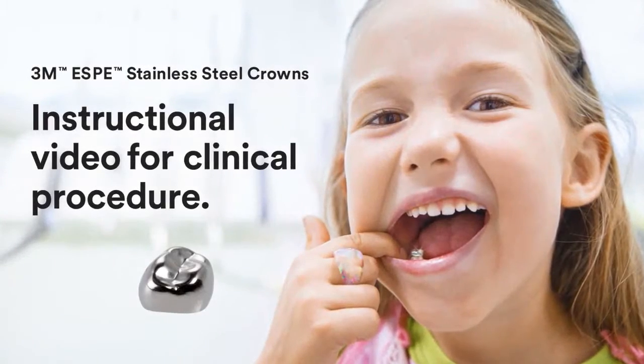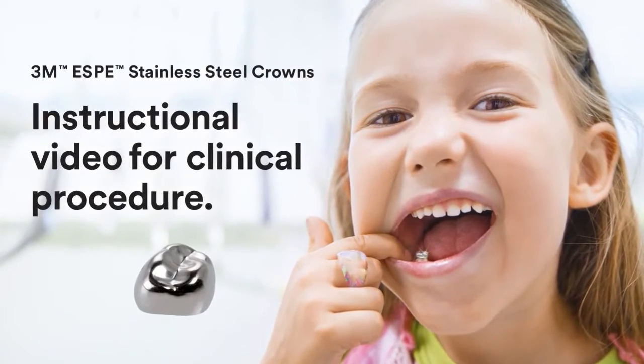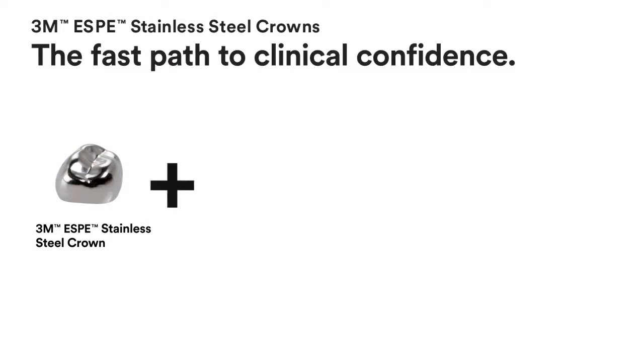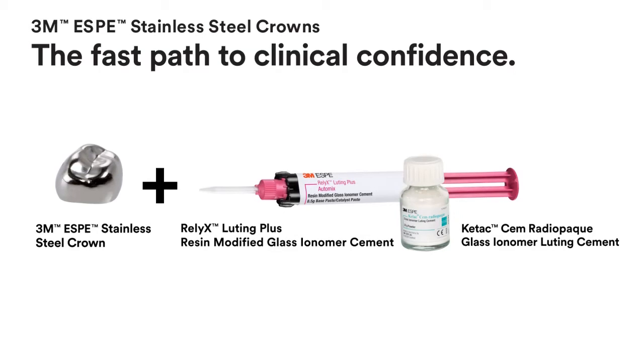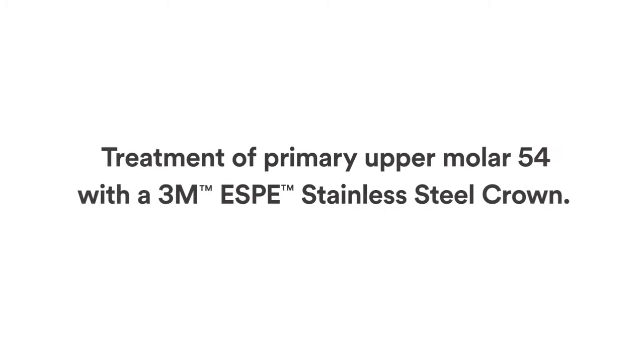With 3M Stainless Steel Crowns, you're on the fast track to clinical confidence. The procedure requires two main products: 3M Stainless Steel Crowns and RelyX Luting Plus Resin Modified Glass Ionomer Cement, or Ketac Cem Radiopaque Glass Ionomer Luting Cement.